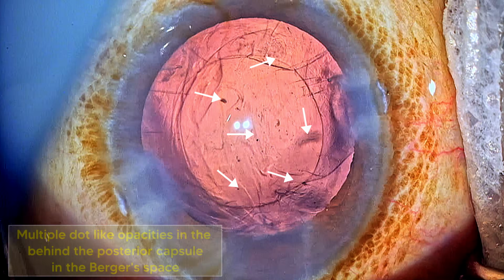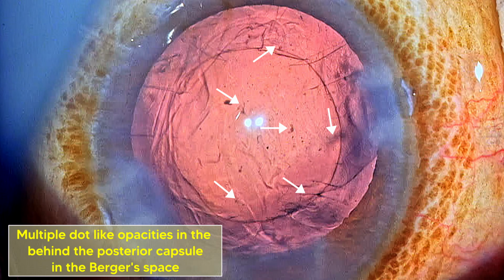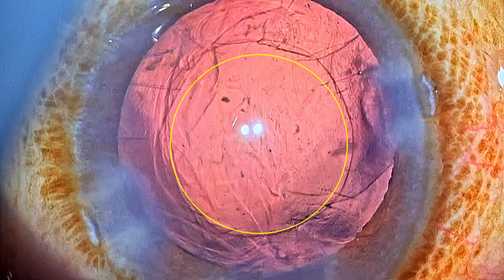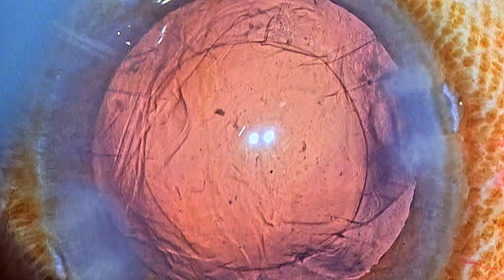We can see multiple dot-like opacities behind the posterior capsule in the Berger space. These are all indicative of the fact that there is probably an anterior hyaloid detachment, and fluid has got access to pass from the anterior segment to behind the posterior capsule in the Berger space.